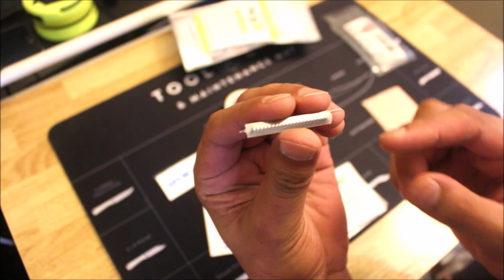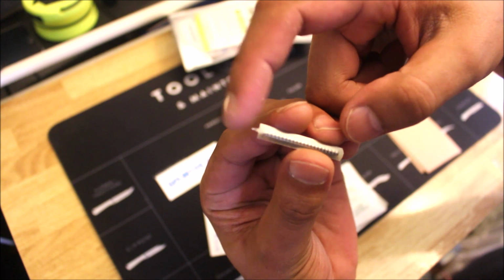Then we have these right here, which are Splinter Outs. I'll go ahead and open one of these if you don't know what these are. I used to have these at a job I worked at. They're pretty cool. They got this really sharp point right here. It's good for several things, really.